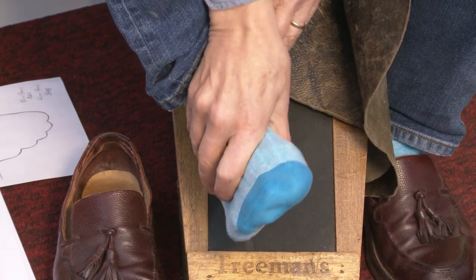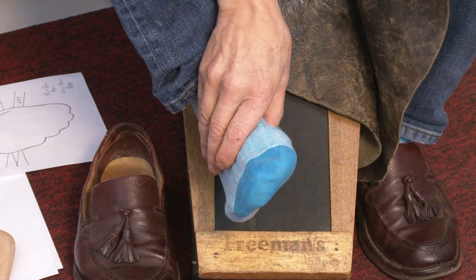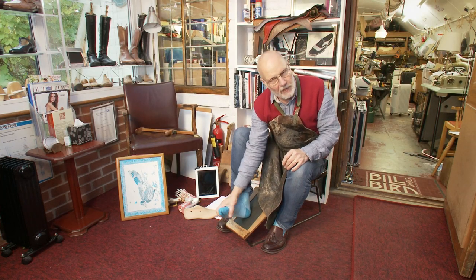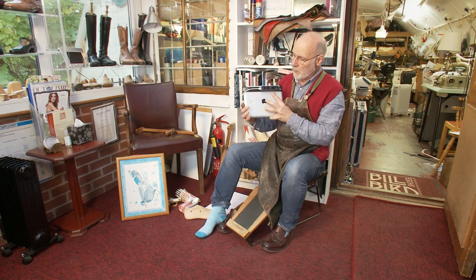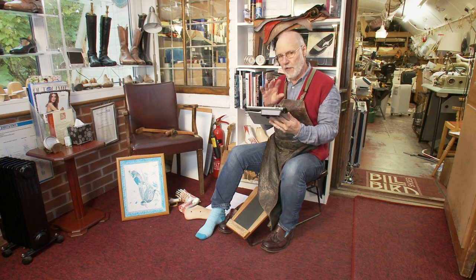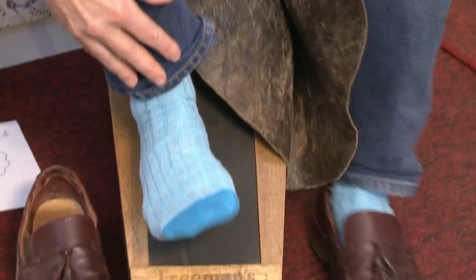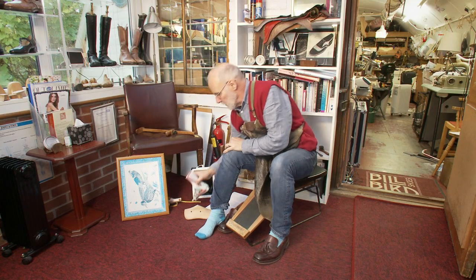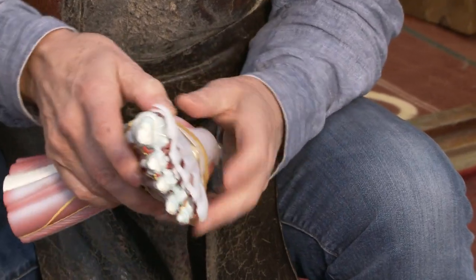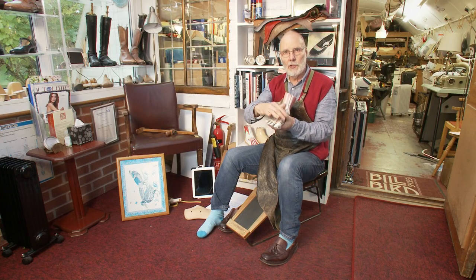When measuring for a bespoke orthopedic last, it's as much to do with palpating the foot — sensitively feeling and exploring it to find where the bony structures are, where the joints bend, where the soft and firm tissues are, and how flexible the foot is. A lot of people ask whether a 3D scanner will eventually replace this process. A scanner measures the surface of the foot — the skin or the sock — but it doesn't tell you what's underneath. This model of a foot with the skin removed shows it's full of tendons, ligaments, bones, muscles, and flexible joints — none of which you get from a scan.